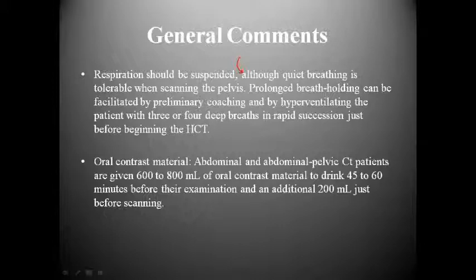because usually my patients are one of 2 types. Either they're excellent and they're in good enough shape to actually hold their breath, or they're incapacitated to the point where there is no way that I can get them to do anything. And so I've never actually tried the hyperventilation technique. It'd be interesting to see if it actually works.